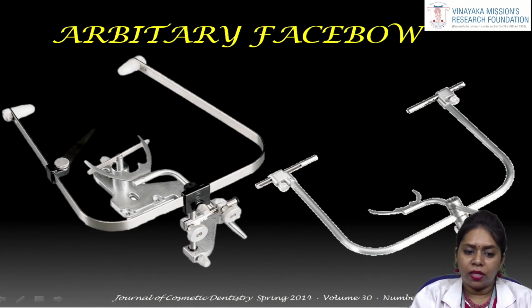The ear type face bow has ear plugs which fit into the external auditory meatus and act as the posterior reference point. It is 6 to 6.5 mm posterior and 2.5 mm superior to the actual hinge axis which is present. The ear plugs are fitted into the auditory pin on the articulator, which has the same dimensional relationship to the axis of the articulator as existing between the hinge and the external auditory meatus.